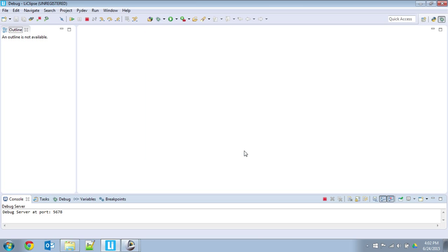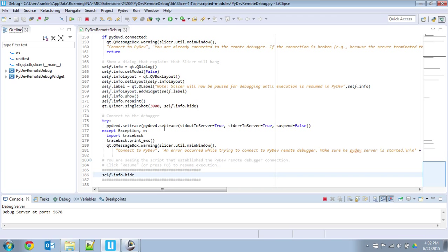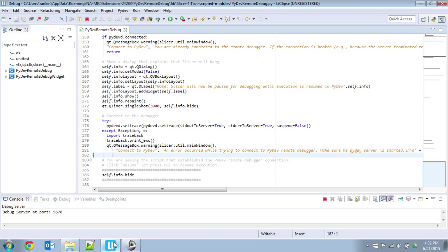You can explore them if you want. And I'm going to choose don't ask again, because we don't actually launch Python from LiClipse. LiClipse always attaches to Slicer, or Slicer, I guess, always attaches to LiClipse. And I don't actually launch anything from LiClipse, so I'm just going to not configure anything at the moment. And you'll see here that it's opened up to the Pydev Remote Debugger module, and it's waiting for us to resume. And so I'm going to resume it, and then you'll see here that Slicer is now responsive again. So now we're connected. We have an active debugging setup.